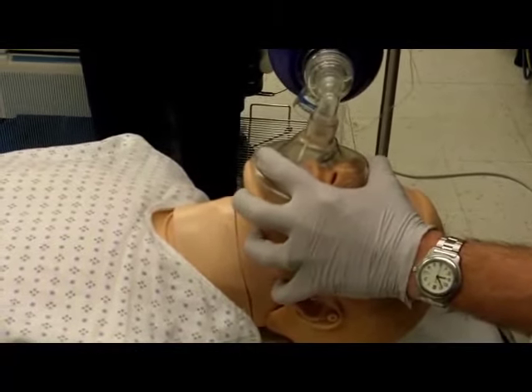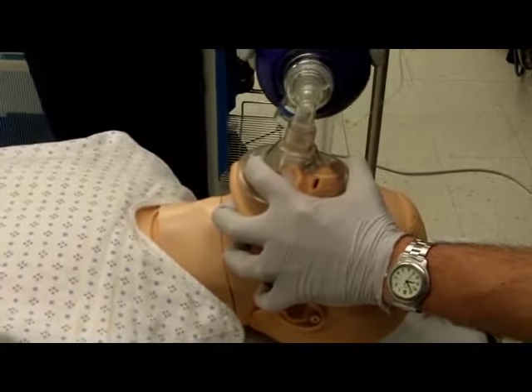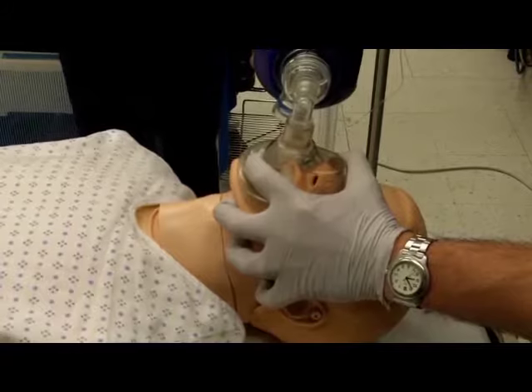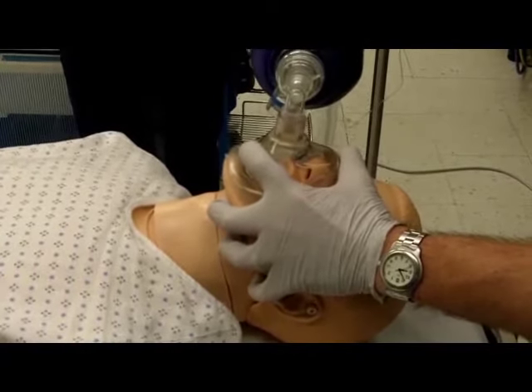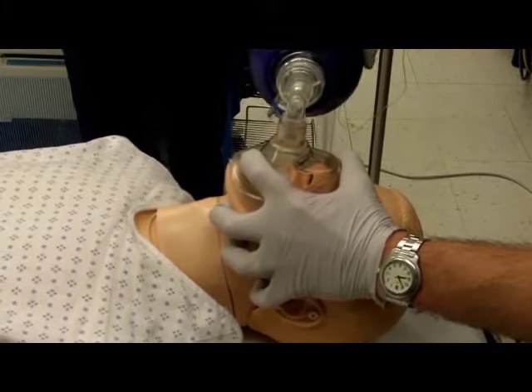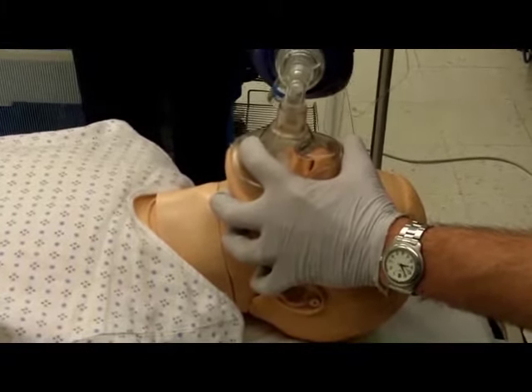A single provider should use the EC grip. The C is created by the thumb and index finger around the mask. The E is created by placing the middle finger under the mentum and the ring and little fingers along the angle of the mandible. Provide jaw thrust with the E.